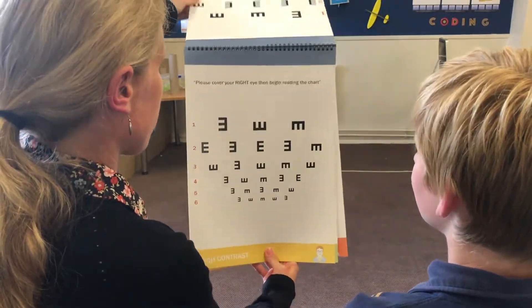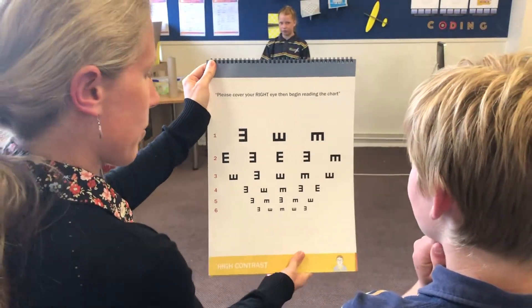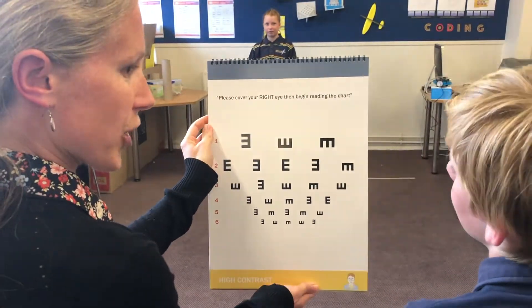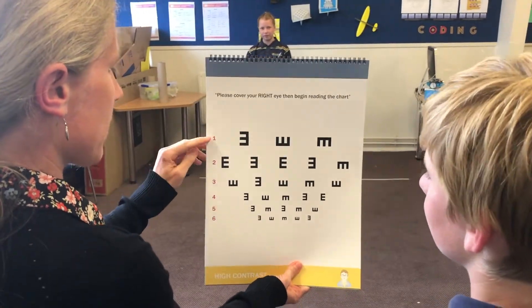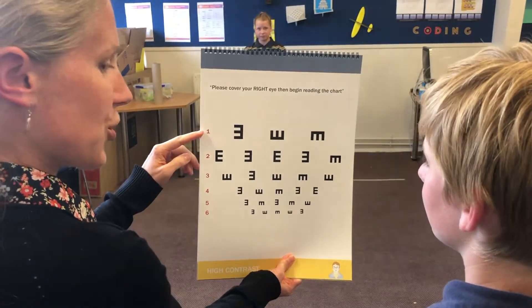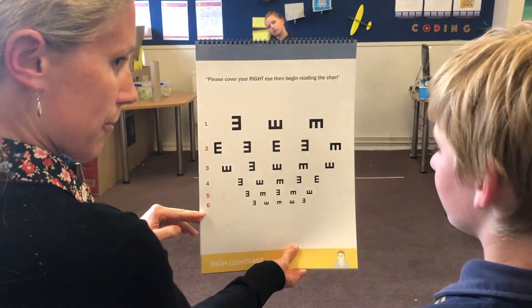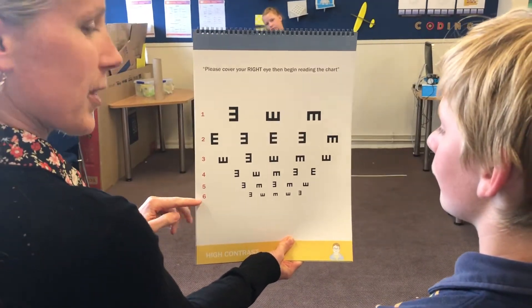I'm going to turn the page. For example, on this page you're going to say: 'Please cover your right eye, then begin reading the chart.' You're also going to say to Maddie: 'Start with row one,' and when she finishes that row, go down to the next row, all the way to the bottom. So start with the big letters and finish with the small ones.